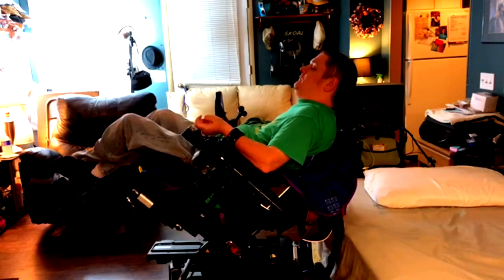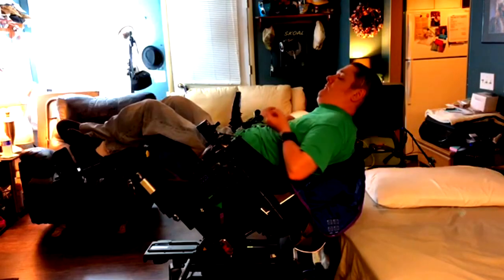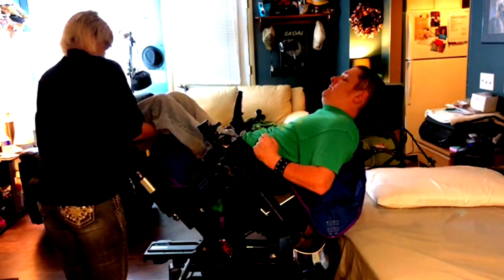I pull up to the bed or the couch that way if I do end up tipping over or sliding out of the chair — which hasn't happened, knock on wood — I have something softer under me rather than the hard floor.